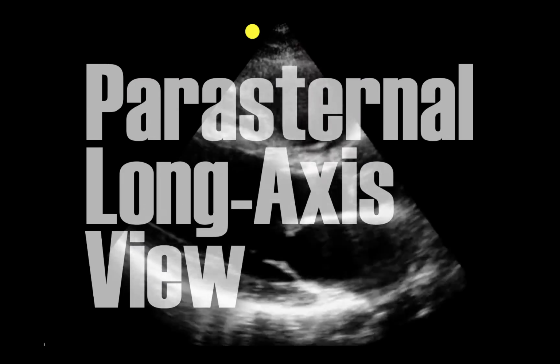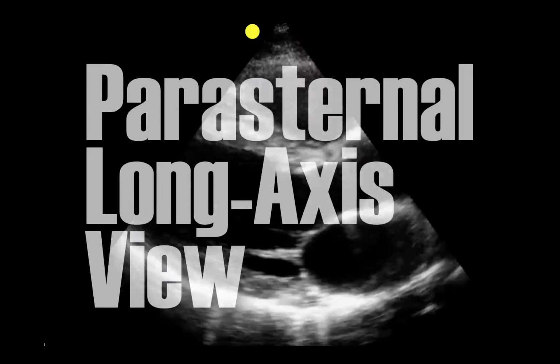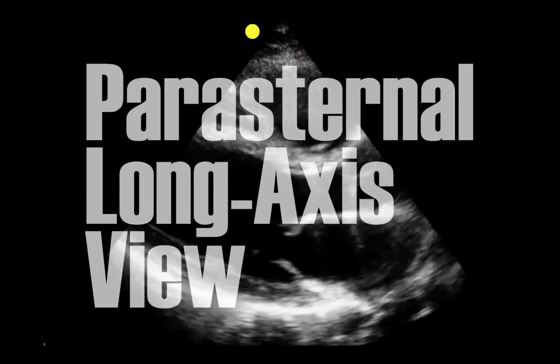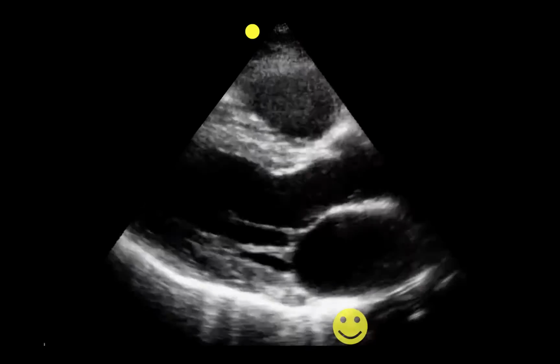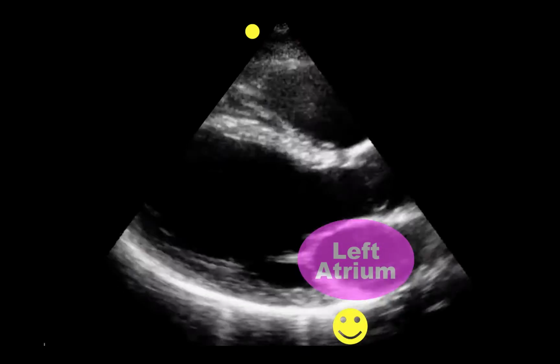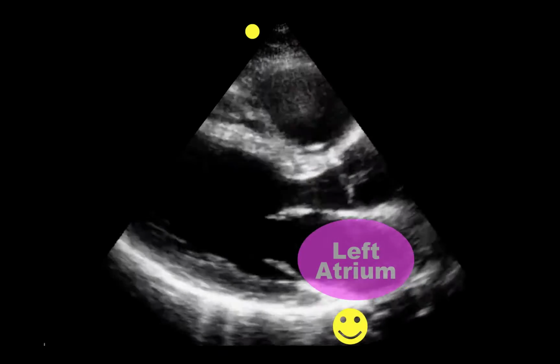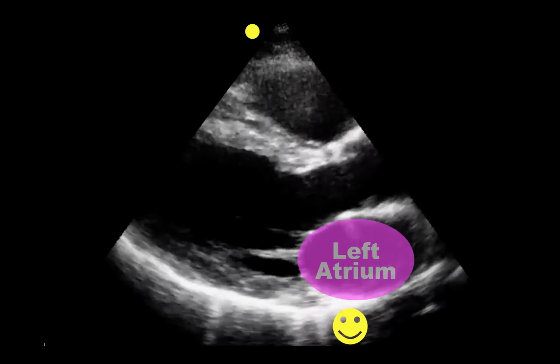Before we go to the answer, I want to show you an approach to looking at effusions on the parasternal long axis view, and this can distinguish between a pericardial effusion and a pleural effusion. What you see here is the descending aorta with that smiley face. And then we have the left atrium. These two structures are so important when we're determining whether or not the person has a pericardial or a pleural effusion. So you want to be sure that you identify both these structures.